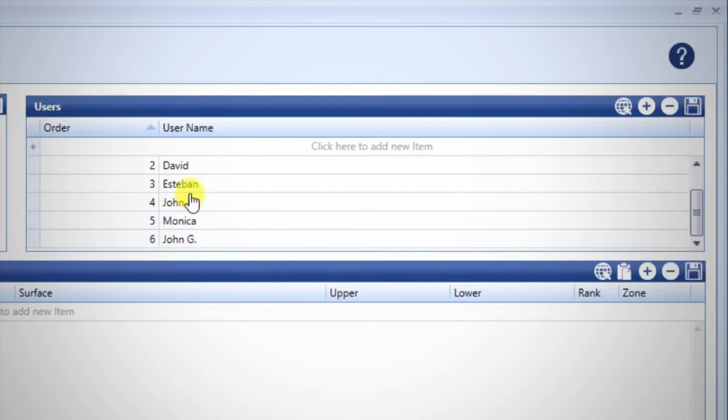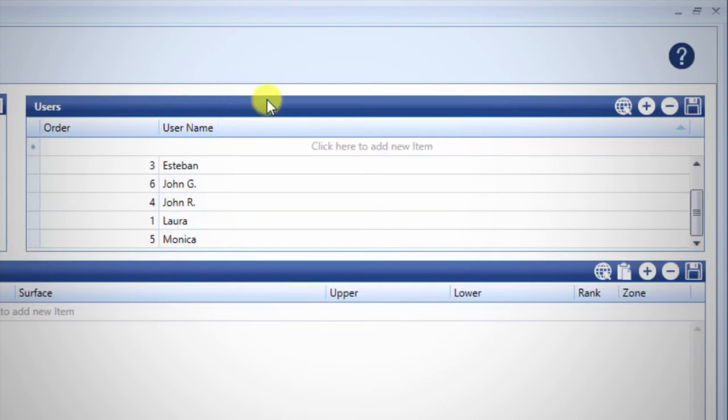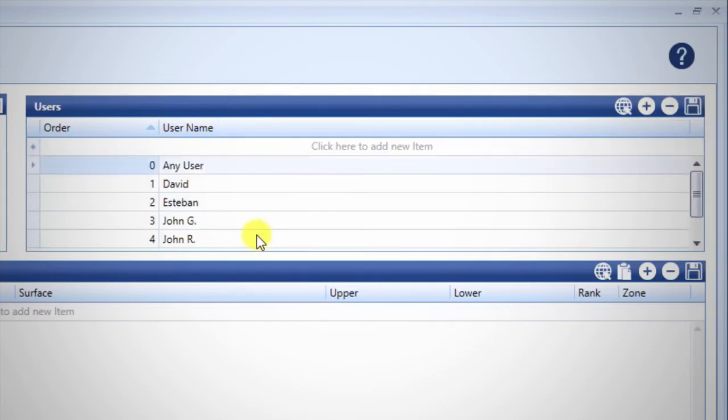You may also sort columns, such as in alphabetical order, then click the Save icon to save the order of names. This will reassign the order number.